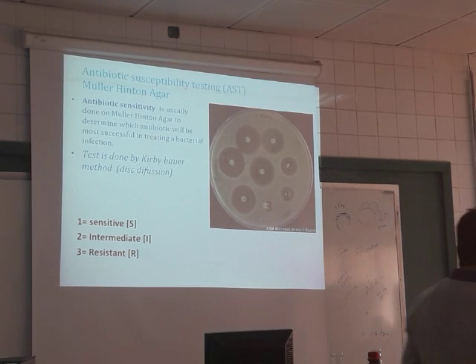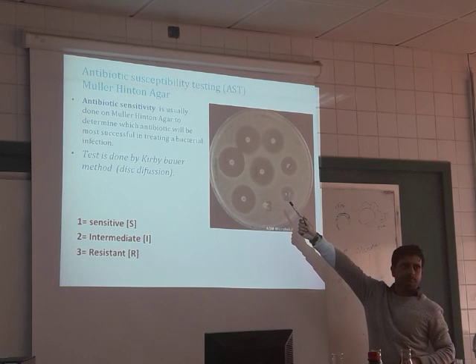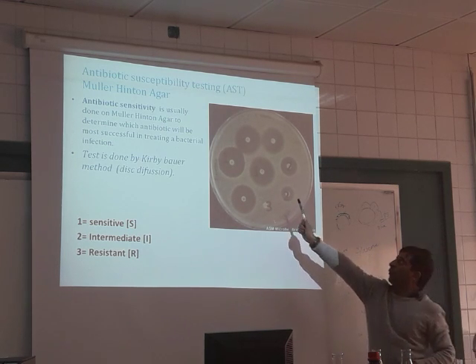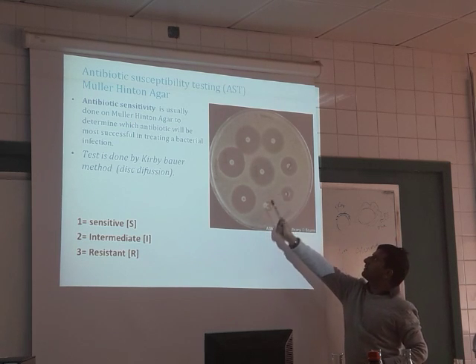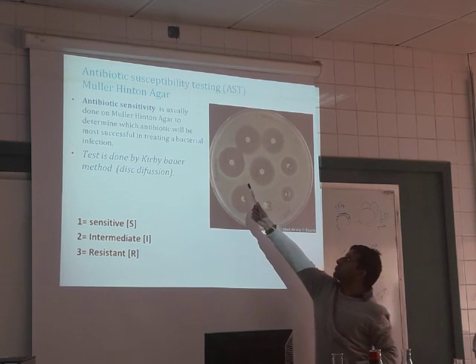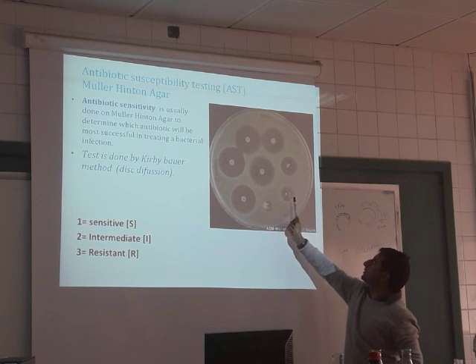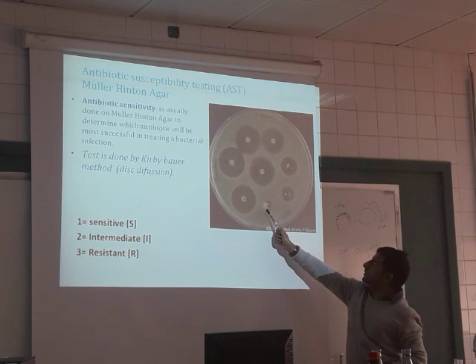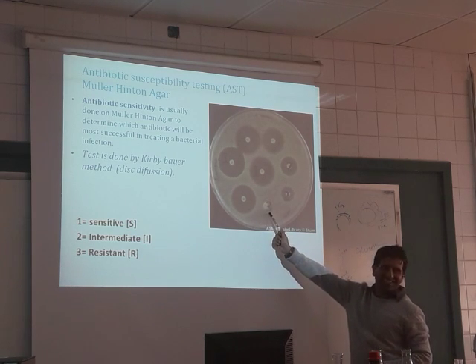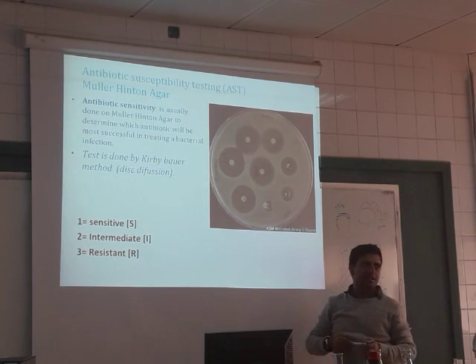Now see at the end here in the antibiotic sensitivity. What is written here? I have put in this picture 1, 2, 3, 4, 5, 6, 7, 8 antibiotic discs, and this is the growth of bacteria. Here there is no growth. There is growth but little, very little growth. No growth. I'm sorry, I said it the reverse. There is growth. There is no growth. There is also no growth, but of different sizes. What does it mean?